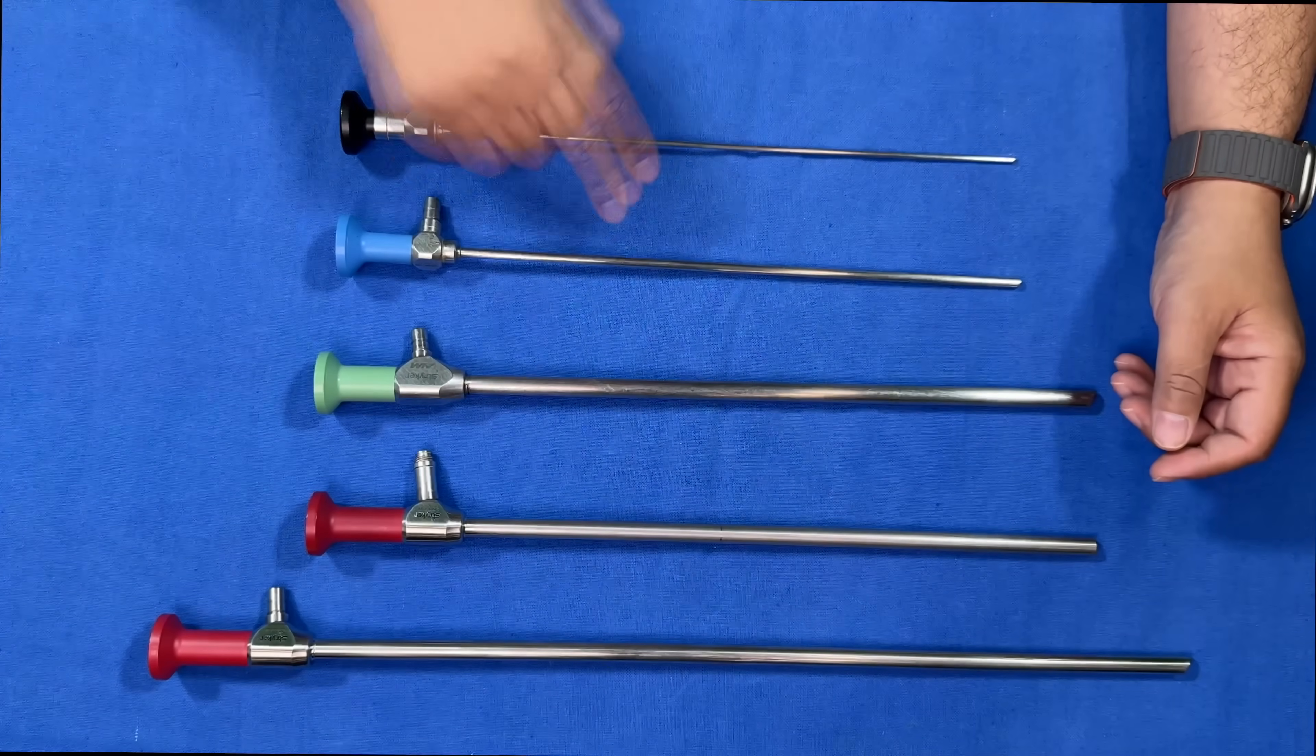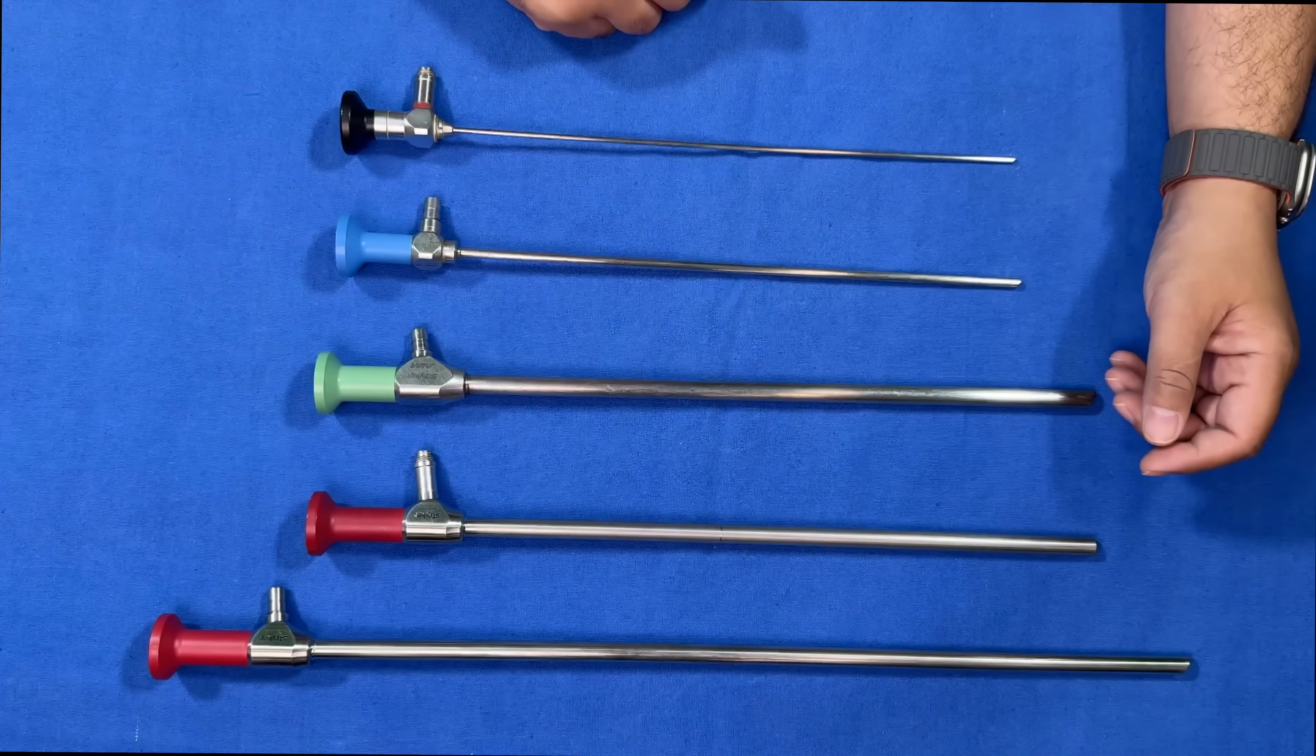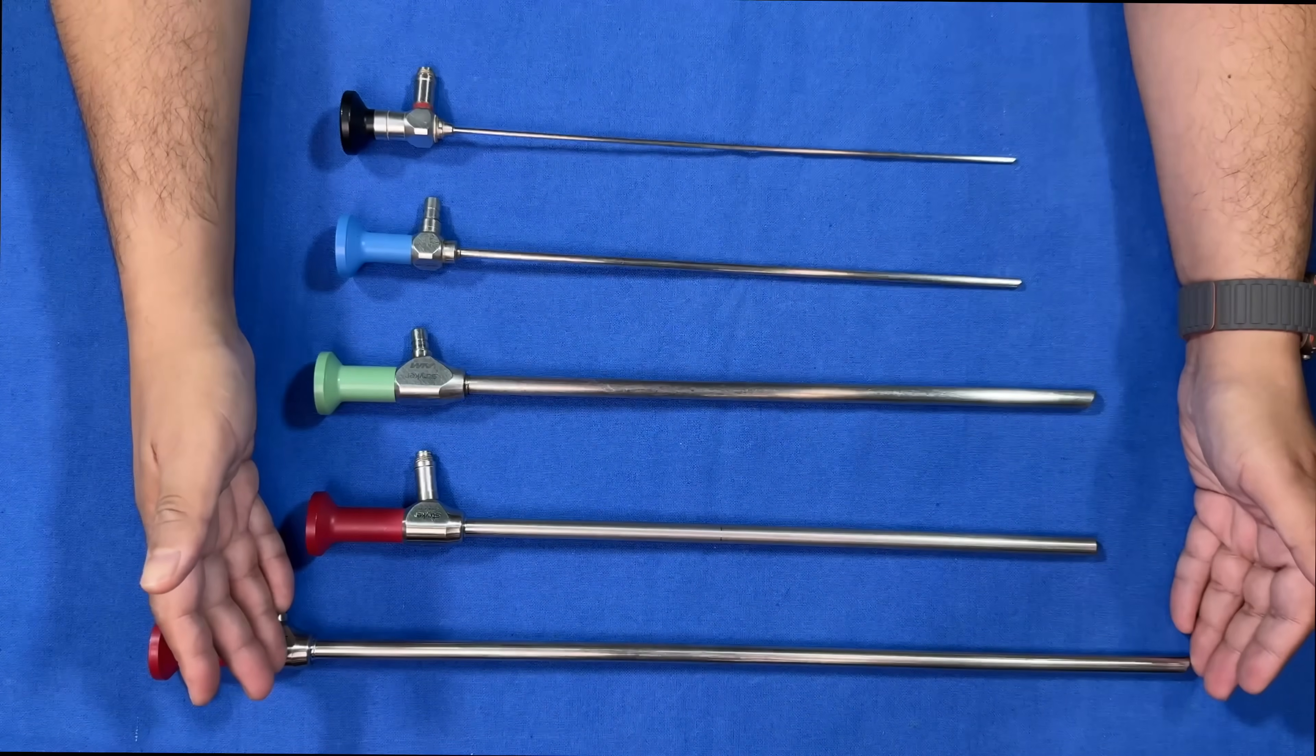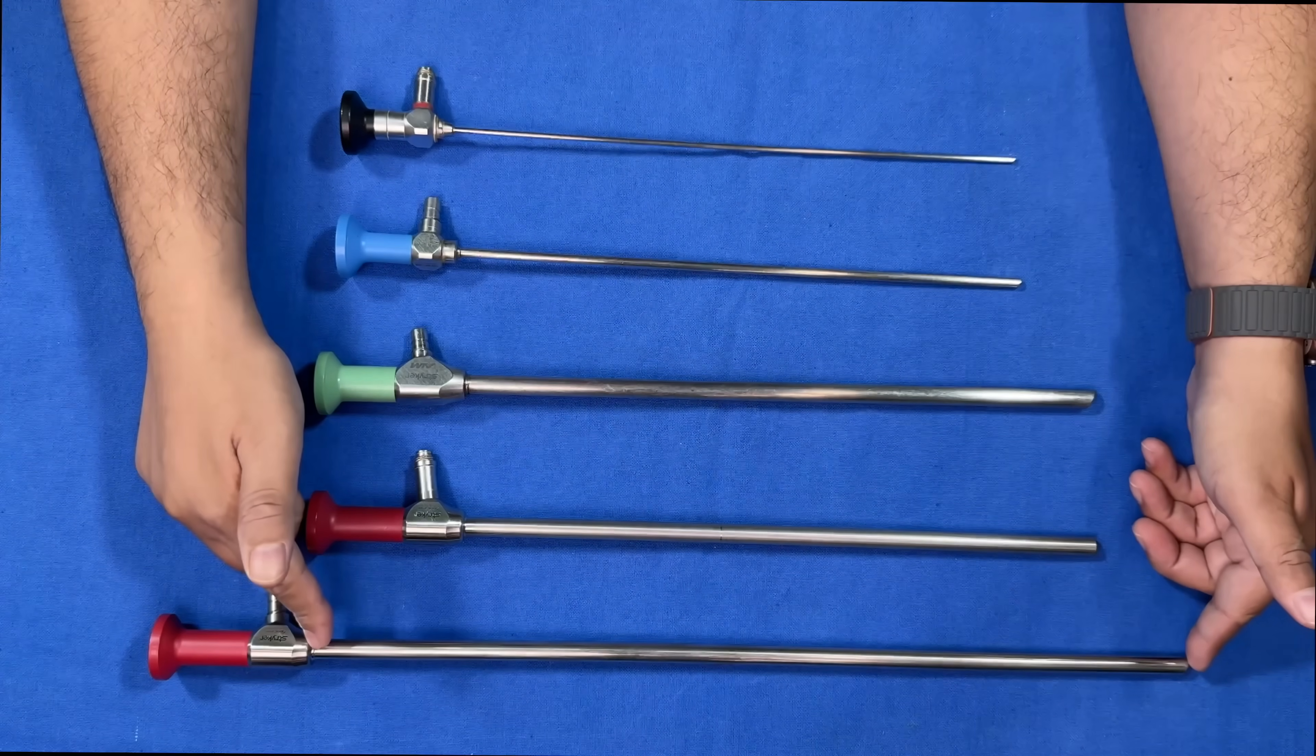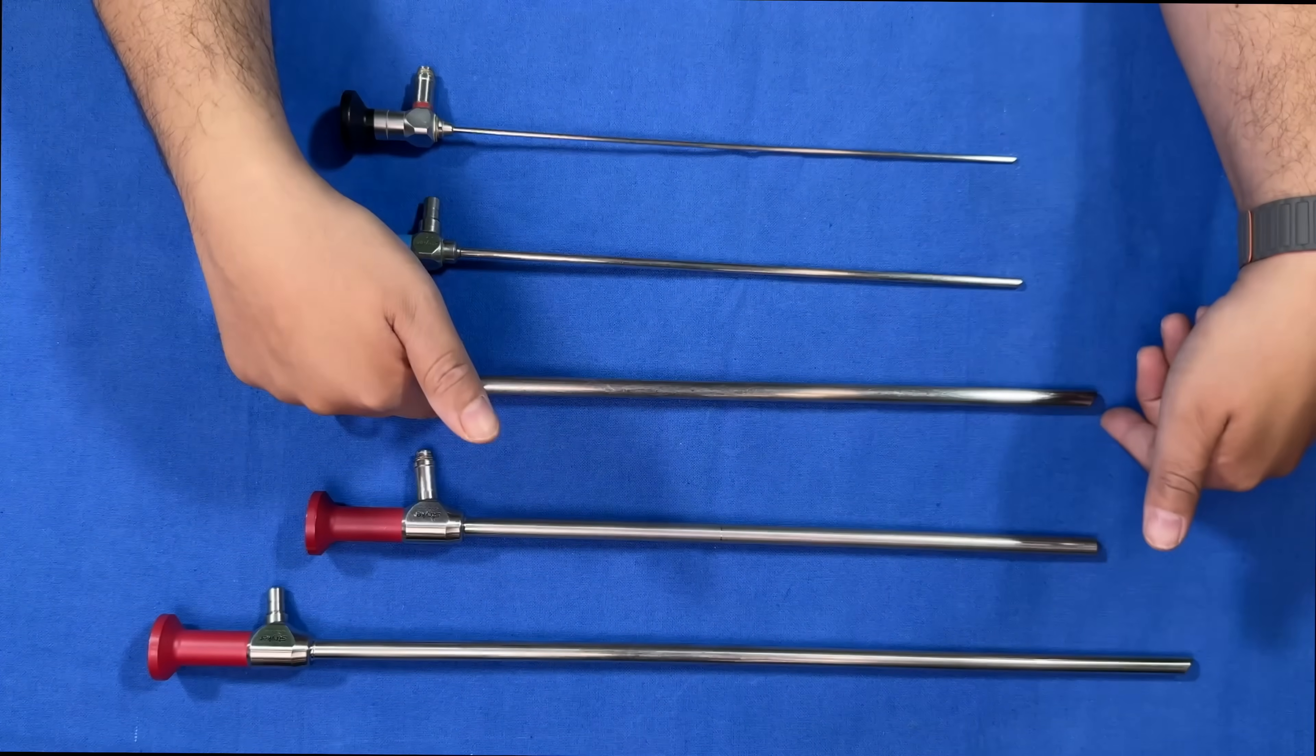These three are 5 mm diameter and the last one is around 2.9 mm in diameter. Regarding length, this is used for obese patients, especially for bariatric surgeries. The length from the tip to this part is around 45 centimeters.